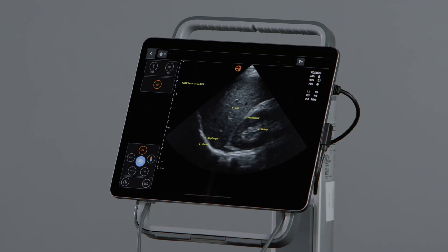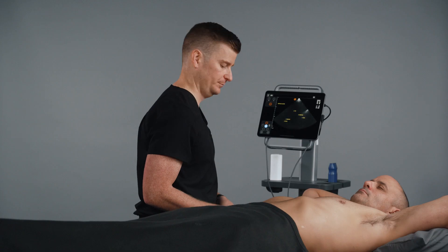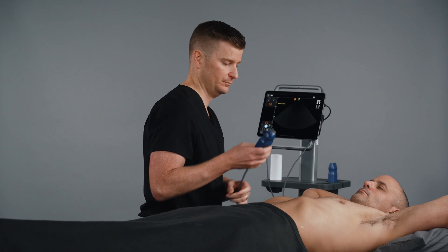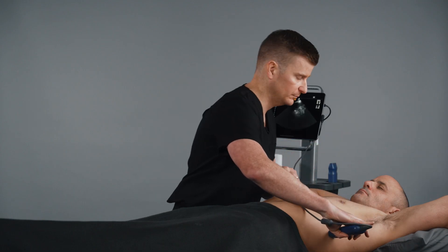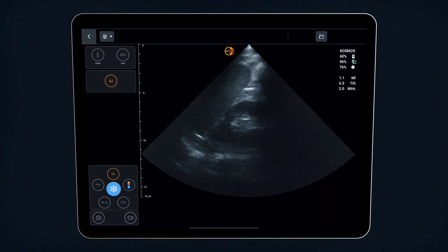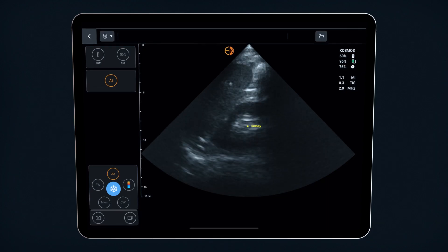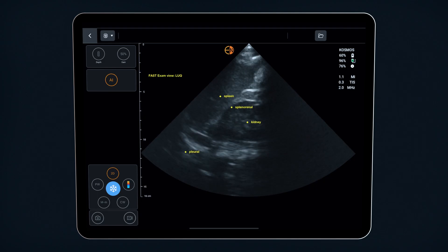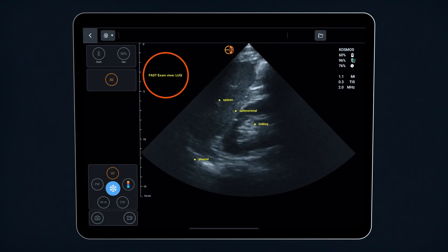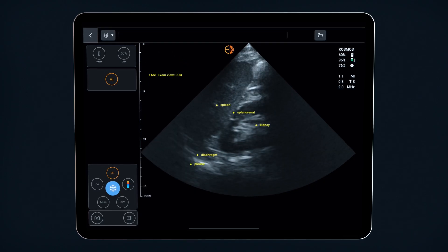As I move from the right upper quadrant to the left upper quadrant, notice how the AI is continuing to label the anatomy as well as the appropriate view noted on the left-hand side of the screen.